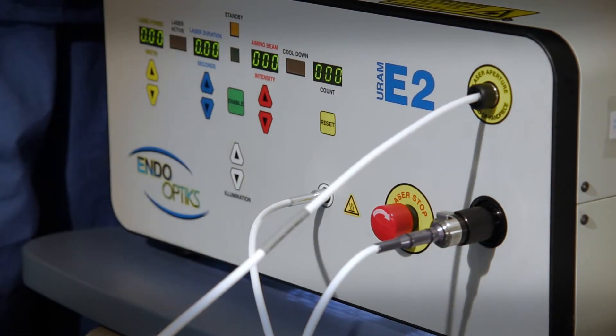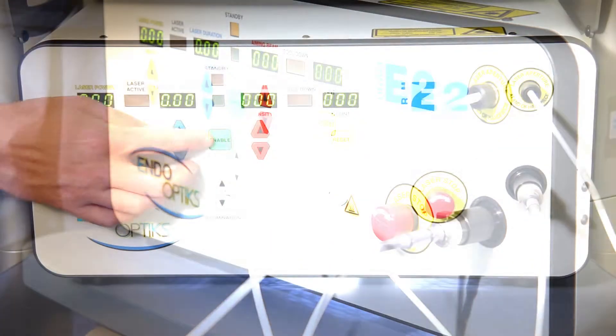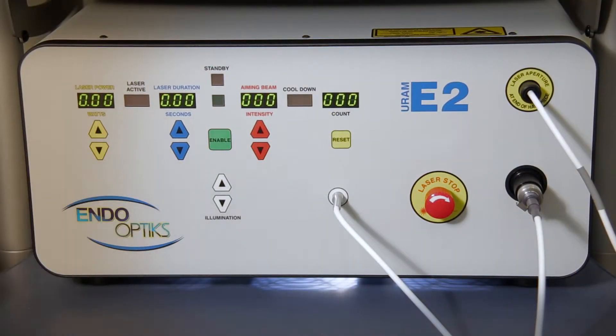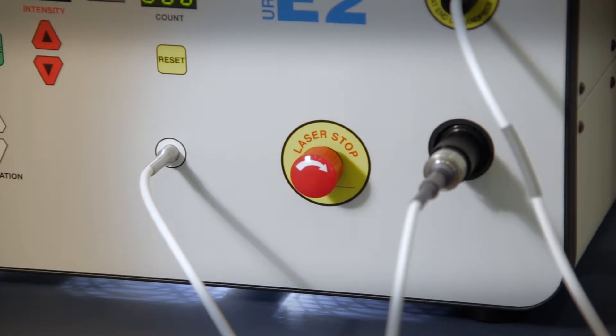If your laser key is turned on with the laser connector in place and the red stop button out, you will hear an audible tone indicating that the laser has been activated. If you do not hear this tone, make sure the laser stop button is in the out position. A small clockwise twist will assure it is set properly.